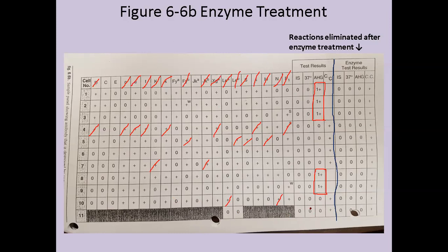We see that we don't expect this to be an auto or recent transfusion reaction because patient tested with patient is negative down here. But we have quite a few specificities left. So let's take a look. Let's do our pattern match.